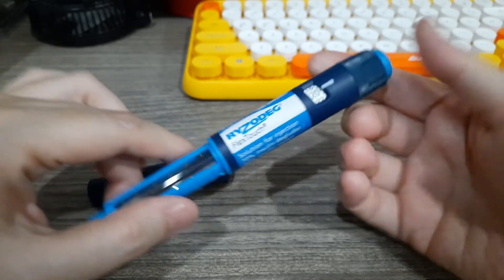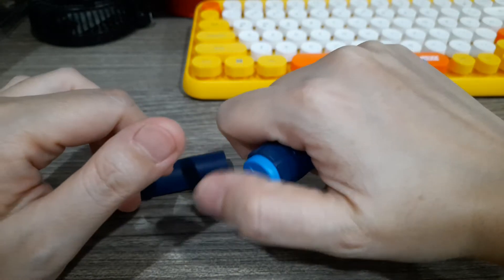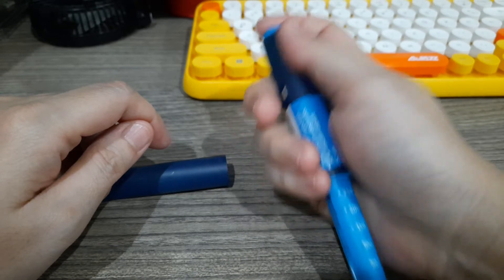So dial to 20 units and then hold it like this. Notice it's more stable holding it this way rather than holding it the other way.